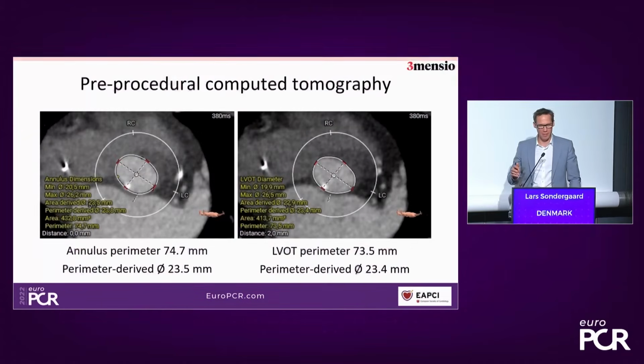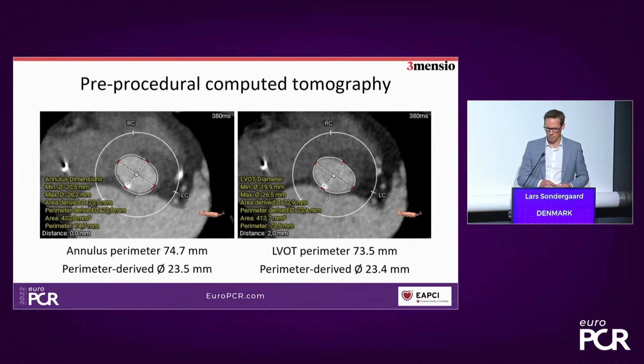So, of course, pre-procedural planning for TAVI really has been refined and developed in the last 10 years. Certainly, at the start of my career, we did a two-dimensional TOE sizing. We did an aortogram during the case to try and find the optimal implant angle, and many of the complications that we had during early TAVI procedures were due to bad decisions that we made from that planning information. And so the CT scan from any of the vendors and indeed the assessment of that raw data is crucial.